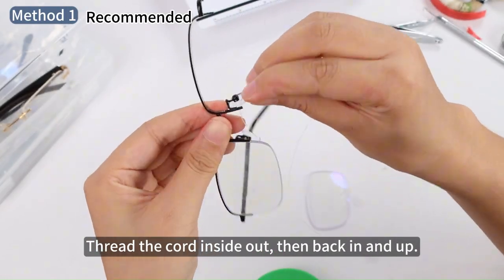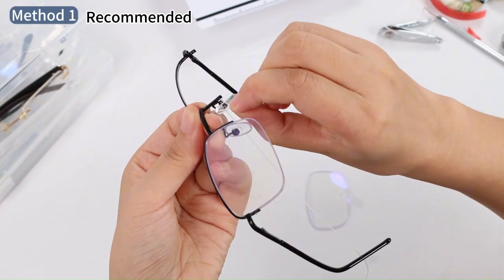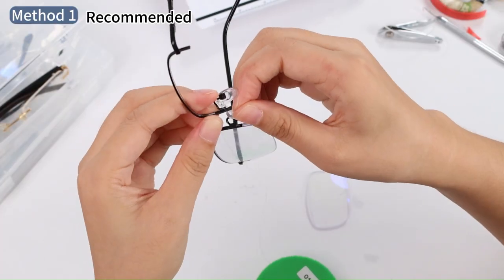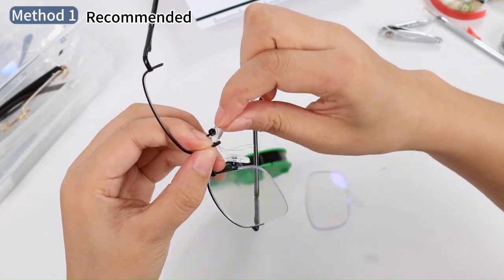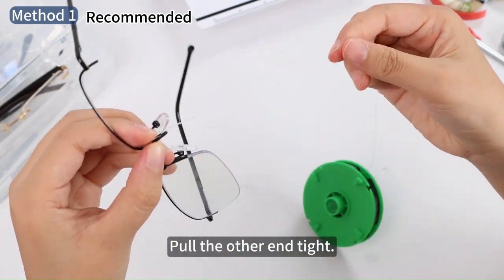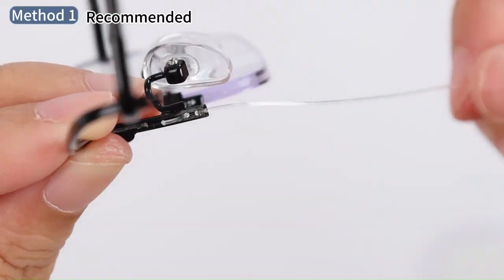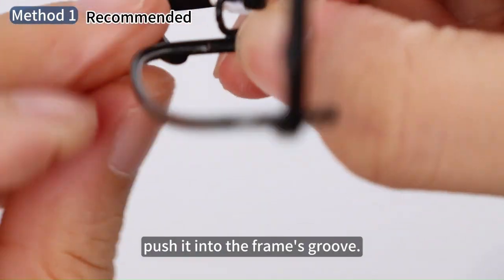Thread the cord inside out. Then, back in and up. Pull the other end to hide the cord, push it into the frame's groove.